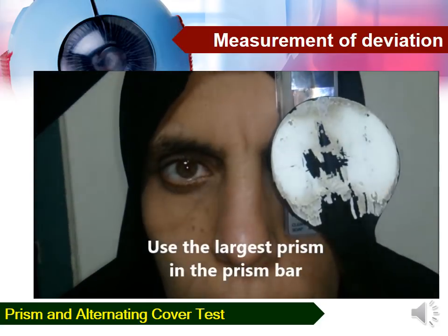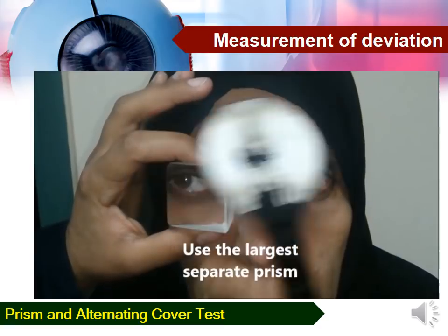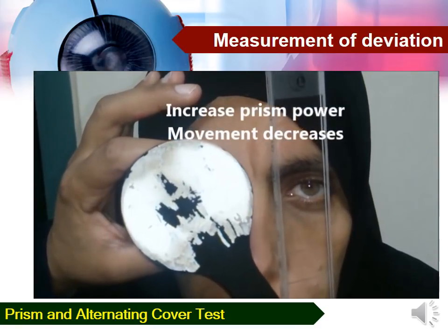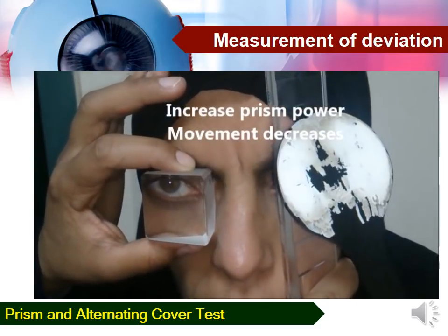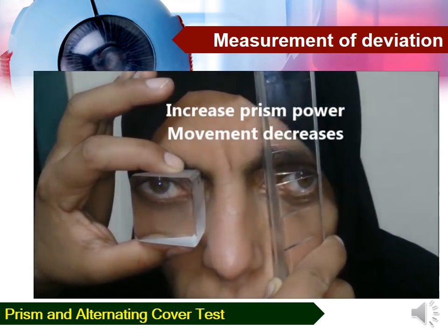You notice in this patient there is still large movement of the eye from out in when using the largest prism on the prism bar, or even when using the largest single prism. So now you have to put prisms in front of both eyes. Remember that you have to put the prisms both base in because the patient is exotropic. You gradually increase the power of the prism until the movement stops.